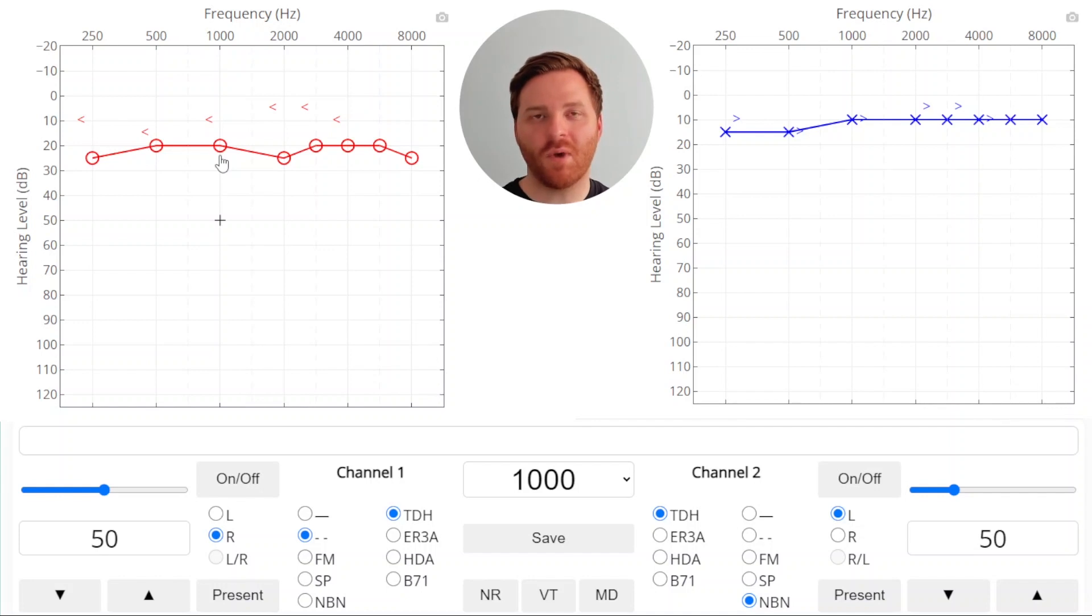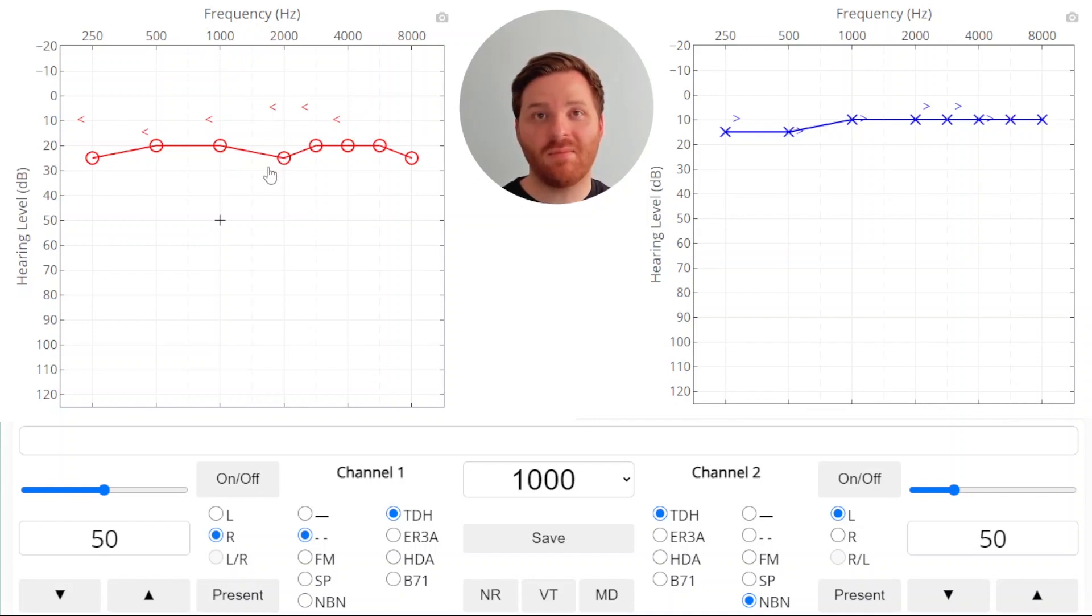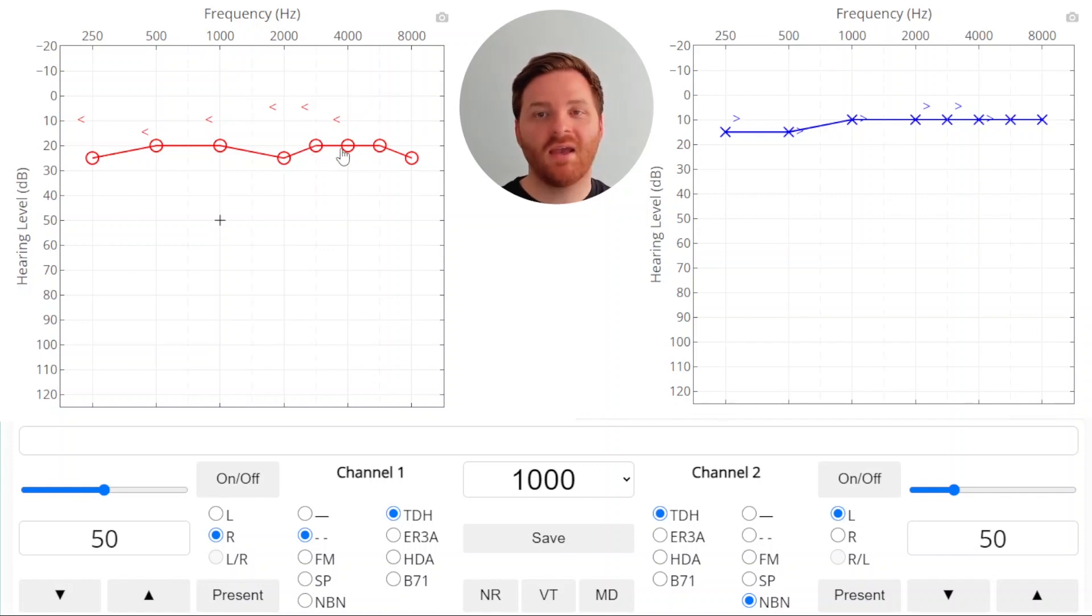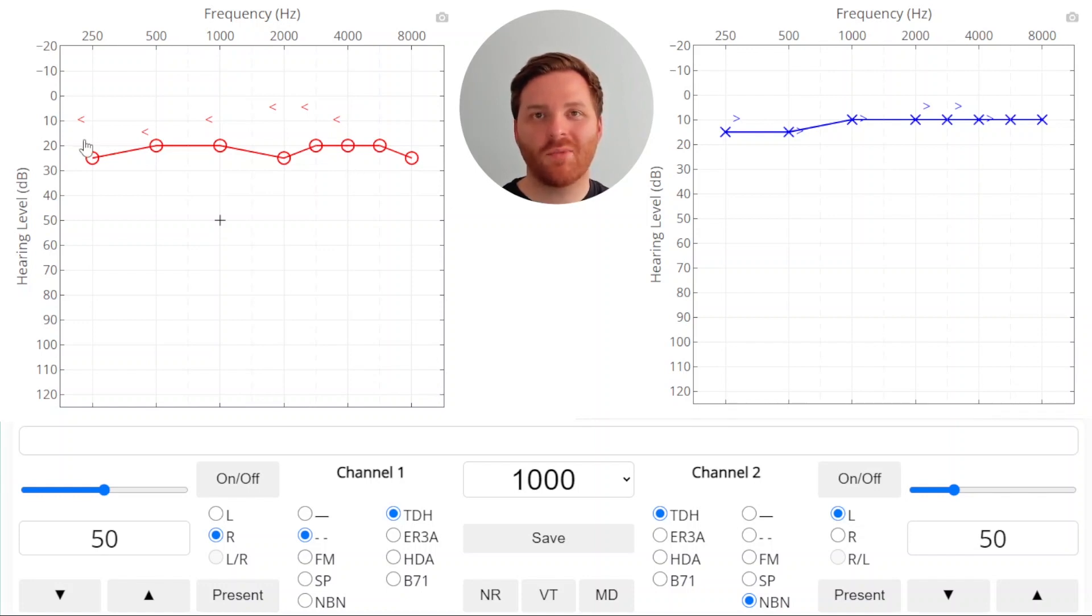2000 has a large air bone gap of 20 dB, so we definitely need to mask there. We have another 15 dB air bone gap at 3k and a 10 dB air bone gap that we don't need to mask at 4k. In summary, we're going to need to mask for bone conduction at 250, 2000 and 3000 Hz, giving us three masked bone conduction scores.